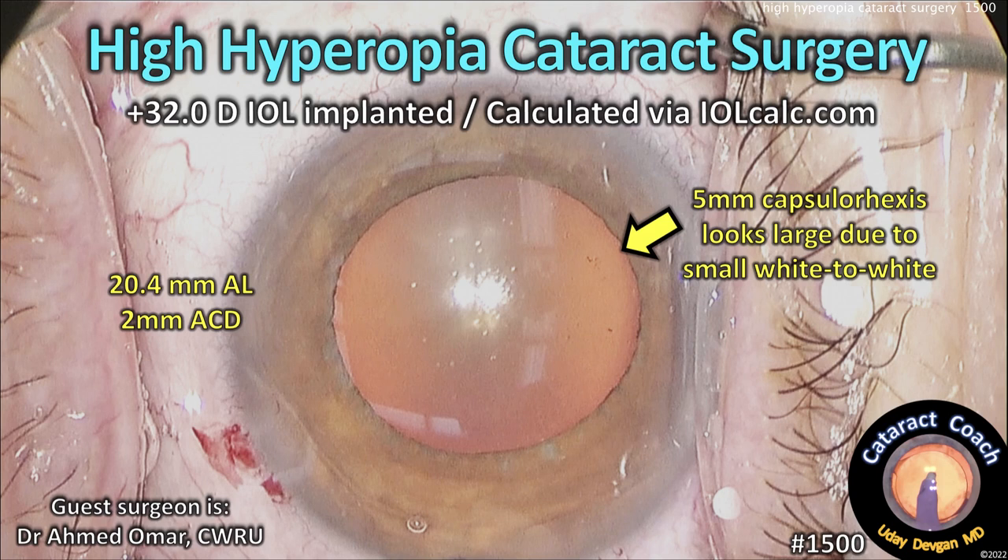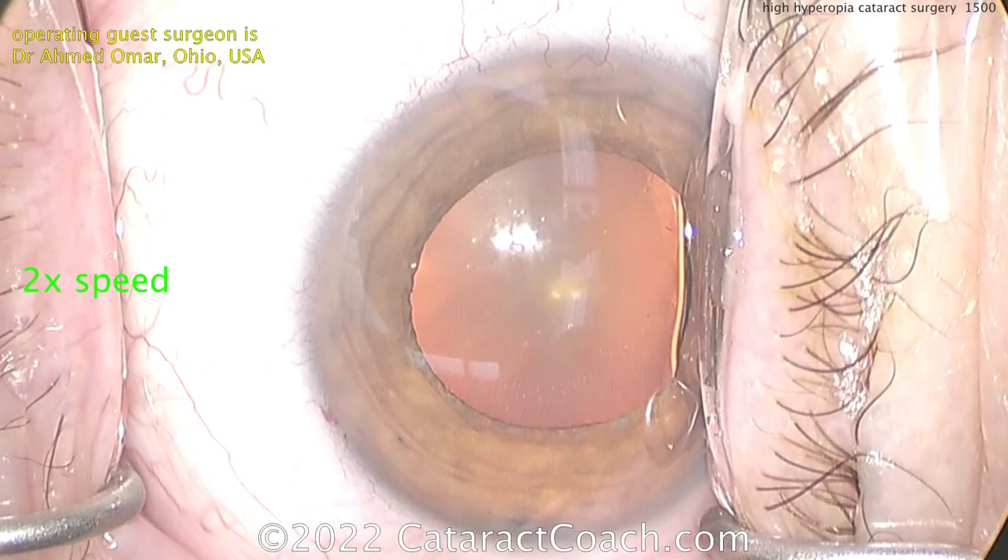CataractCoach.com. High hyperopia cataract surgery — a very small eye with a 32 diopter lens implanted and calculated with iolcalc.com.